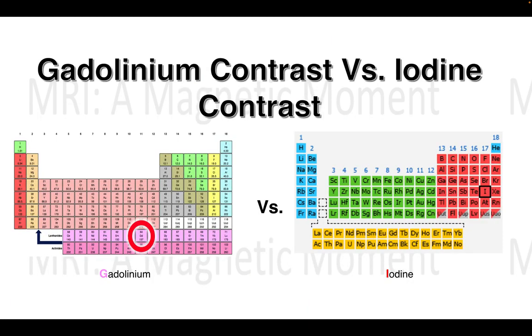Okay, moving forward, let's discuss MRI contrast briefly. I'll upload material on MRI IV contrast in coming weeks for your review, but gadolinium contrast appears to be an effective agent for MR imaging. This contrast basically consists of magnetic molecules that are suspended in a clear solution, and it goes through the patient's vessels or bloodstream and gets processed in the kidneys, and within 24 to 48 hours gets out of the system through the urinary tract.